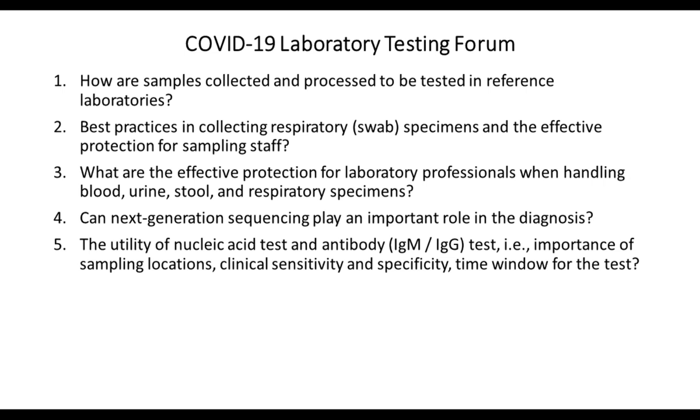Thank you for the introduction. We have collected samples with swabs, usually throat swabs or nasal swabs, and also deep sputum and BAL, bronchial lavage fluid. BAL is usually collected by a physician, and we usually collect swab samples. For the swab samples, there is a standard procedure which can be seen from the video available online.